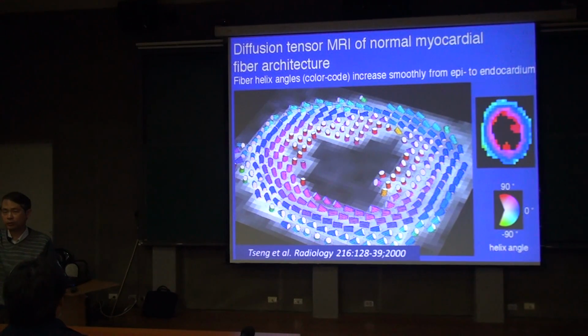We connect all the local fibers according to some criteria, for instance streamlining. If you use software like MATLAB, you will see streamlining. Streamlining means if there is a vector field, you connect the vectors that are very similar and have a small angular deviation, and you connect them into curves, right? So this is called tractography.